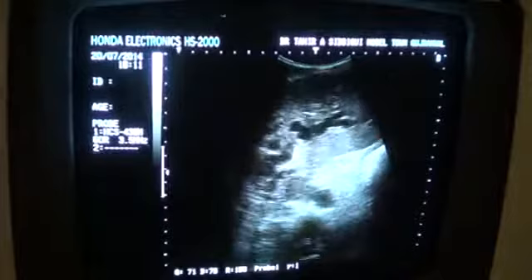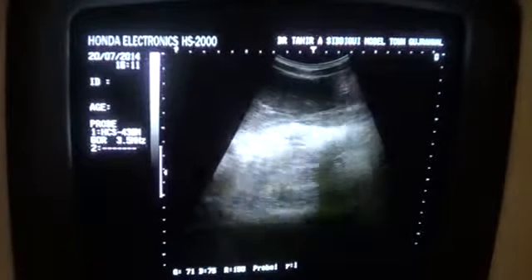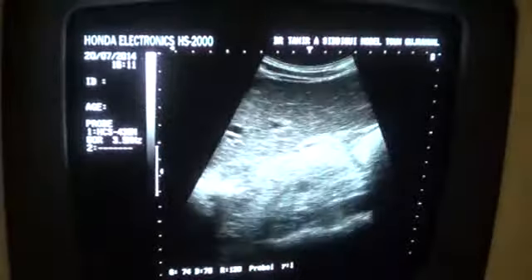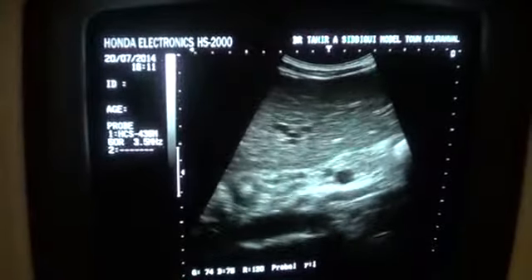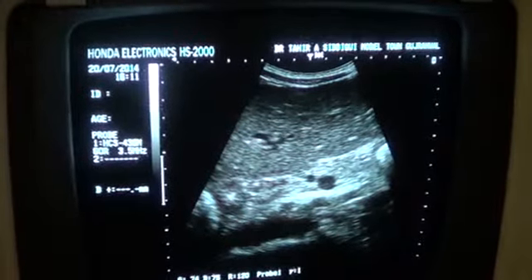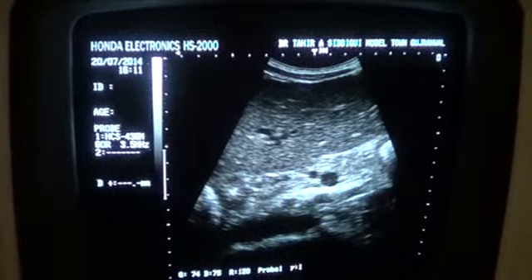and this is the left lobe of the liver, and the left lobe of the liver is significantly extending beyond the origin of the superior mesenteric artery from the aorta. Here you see, this is the superior mesenteric artery arising from the aorta, and this is the head of the pancreas. This is the portal vein, and we do not see any focal lesion relating to the head of the pancreas.